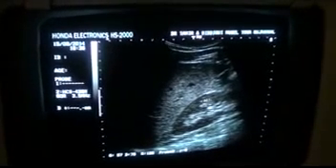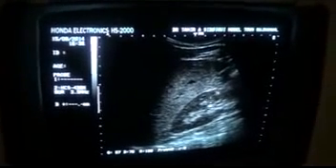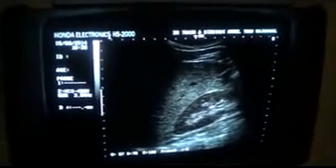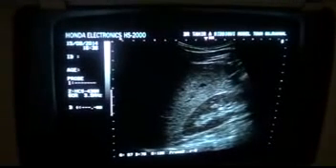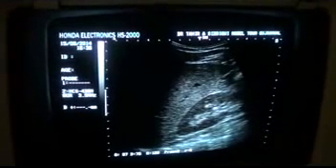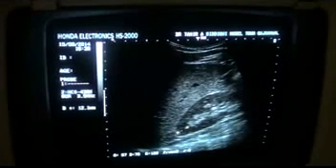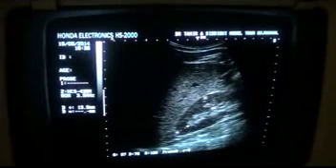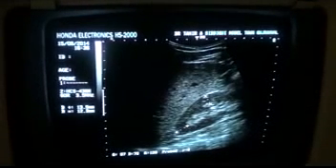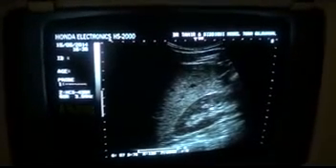Now these tiny cystic areas are the pyramids, renal pyramids. So in this patient, the corticomedullary differentiation is intact. Now what about the thickness of the parenchyma? Parenchymal thickness is normal. We include both the cortex and the medulla, and we can see that the thickness is preserved.